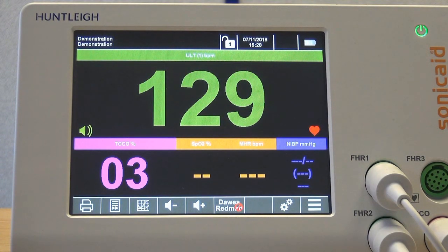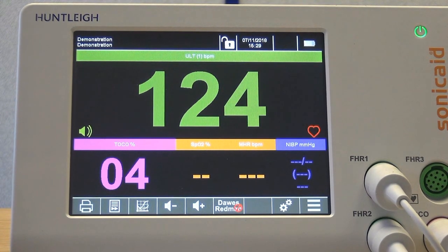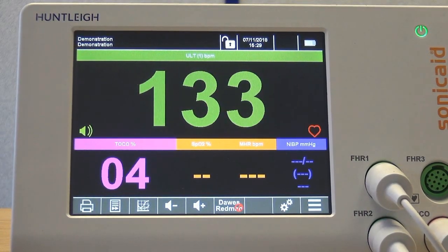When you make any setting changes, for example an alarm setting change, these are used just for the current session. When you switch the unit off, these local settings will revert back to the default settings at the next switch on. This section shows how to save the current local settings as the new default settings.